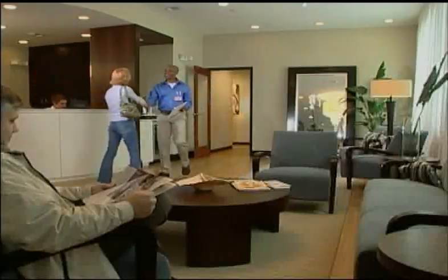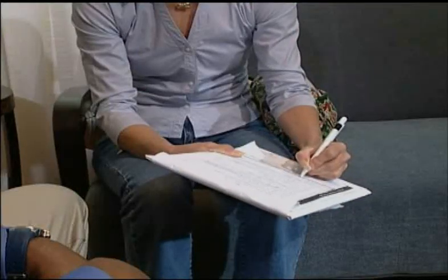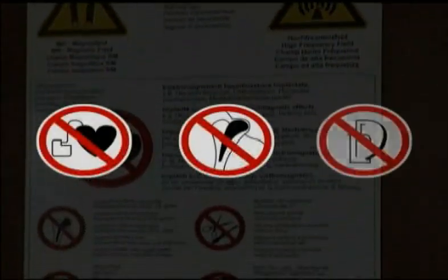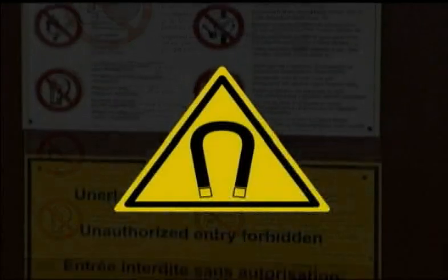On the day of your examination, it's a good idea to arrive a little early in order to complete your patient information records and to allow for a pre-examination screening. At this time, you may be asked some questions to make sure that you are eligible to undergo the MRI examination. For instance, patients with metallic foreign bodies or surgically implanted devices, like cardiac pacemakers and aneurysm clips, are not eligible. These devices may be adversely affected by the magnetic field.